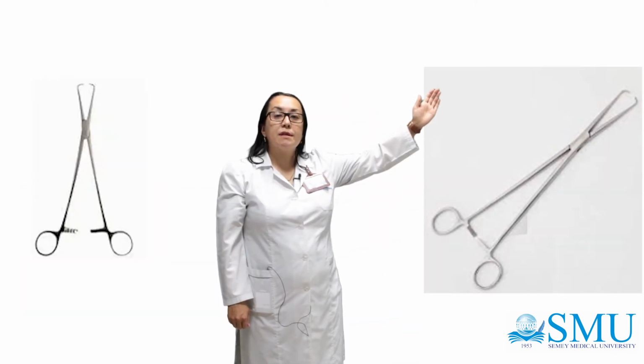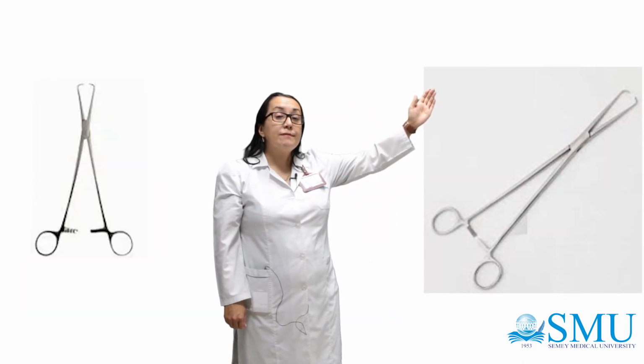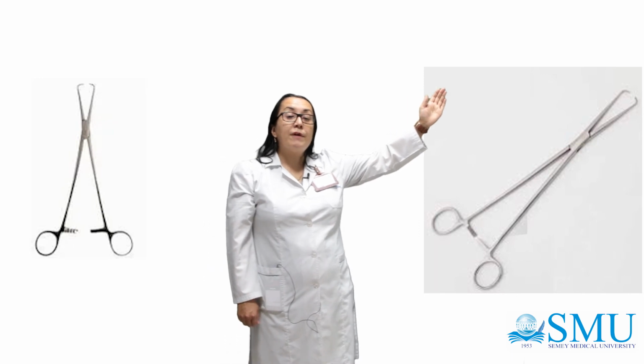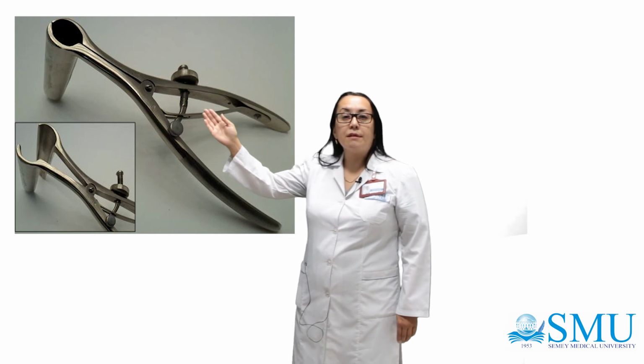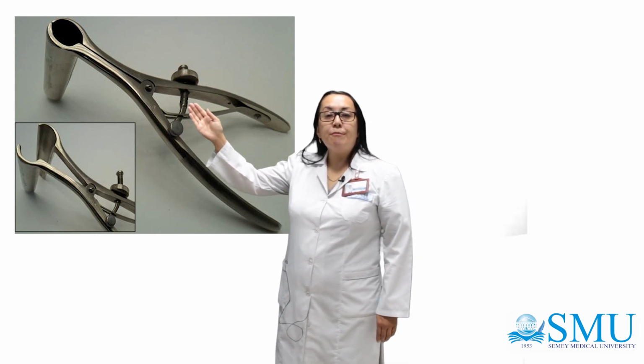Bullet forceps, used in obstetrics and gynecology for holding uterine tissue. Rectal speculum, used for diagnostic and treatment operations of the rectum.